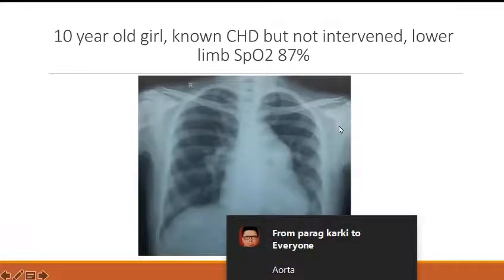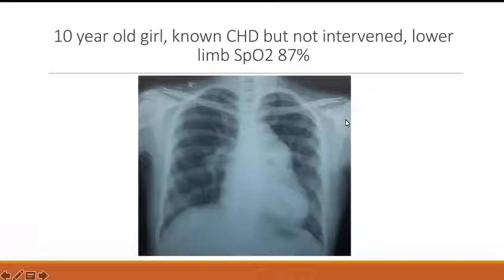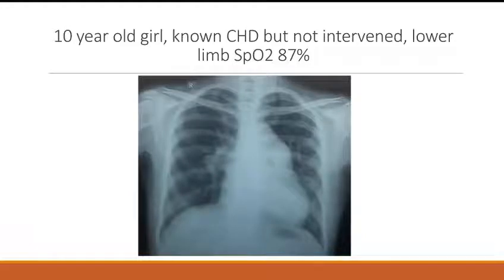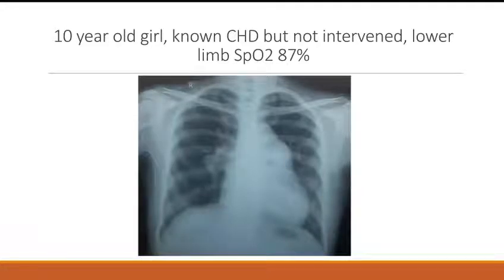In PDA with Eisenmenger, the aortic knuckle will also be prominent and the shunt is extracardiac. In VSD, the great vessels will be normal and RV type of apex will be there. In ASD, dilated right atrium will be present, and apart from that great vessels will be normal.